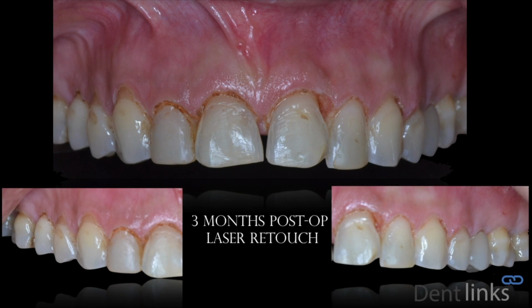And this is the result 3 months post-op. It's important to wait the proper amount of time. It is 3 months according to the literature. We do a small laser touch-up to define properly the gingival contours. With this very satisfying periodontal result, I would leave the floor to Dr. Ziad Saleme to guide you through the prosthetic rehabilitation of that patient. Thank you.